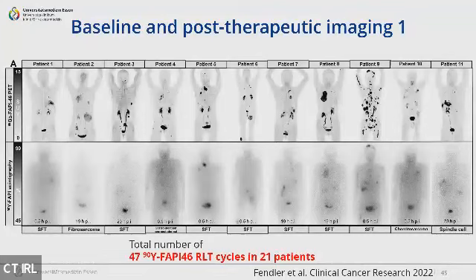These are images. Of course, it's theranostic, so each indication and each treatment is being followed by making images to it. The lower row is the Y90 scintigraphy or Bremsstrahlung images, which really show how the treatment acts. So this is an image that is being performed under treatment. It shows the radioactivity that goes into the tumor and treats the tumor. In the upper row is FAP PET at baseline that needs to characterize and needs to make sure that all the tumor diseases and all the lesions can really be targeted by this new type of treatment.